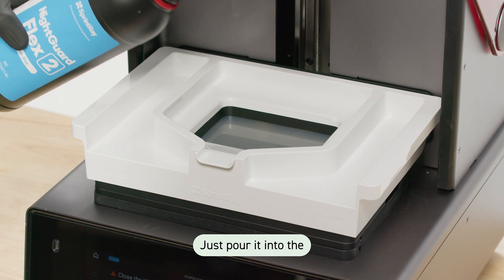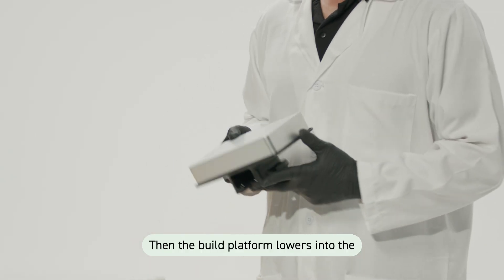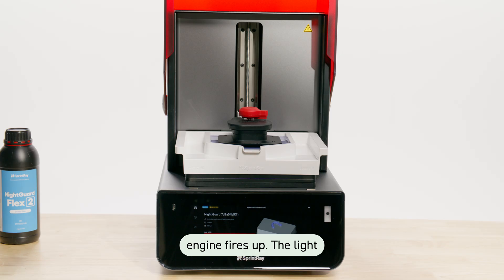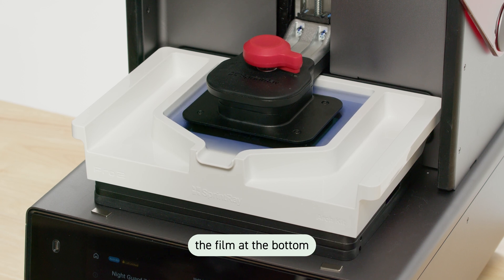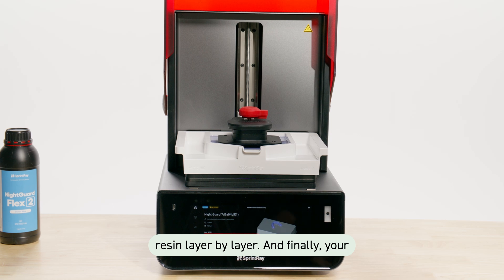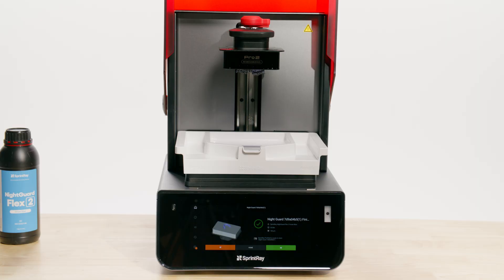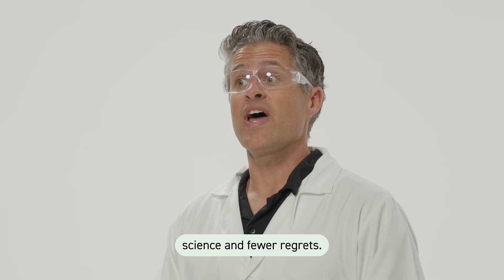Next up, resin. Just pour it into the tank — no mess, no guesswork. Then the build platform lowers into the tank. Underneath, the light engine fires up. The light shines through the optical panel, through the film at the bottom of the tank, and cures the resin layer by layer. And finally, your print rises from the resin like a dental phoenix. It's like magic, only with science and fewer regrets.